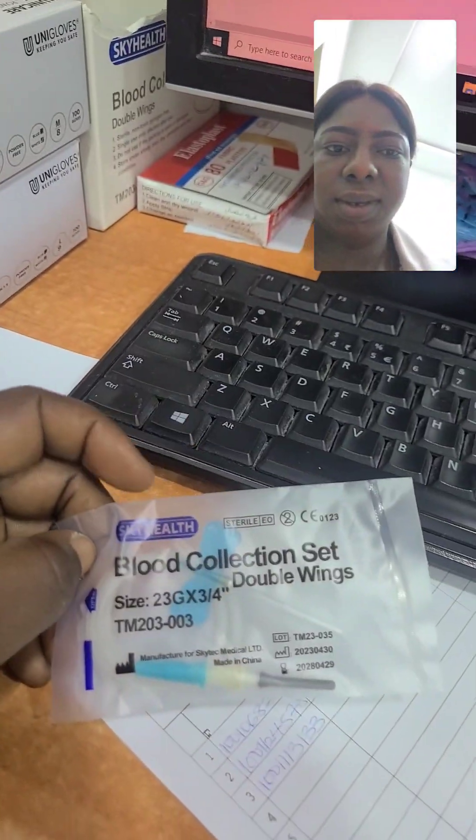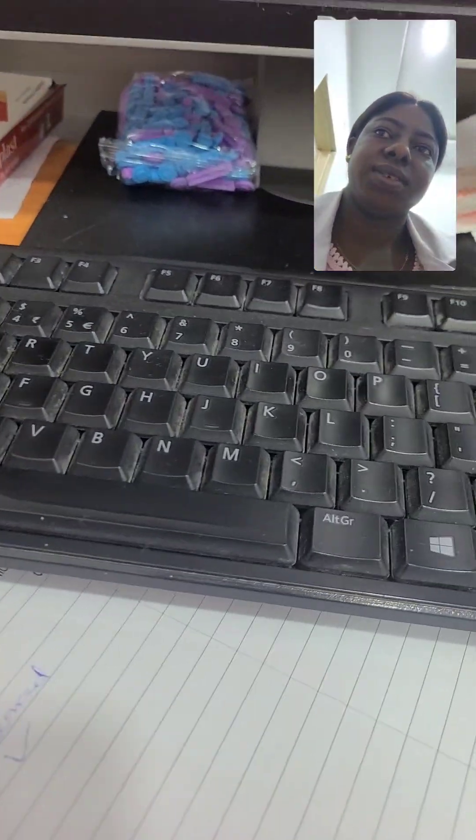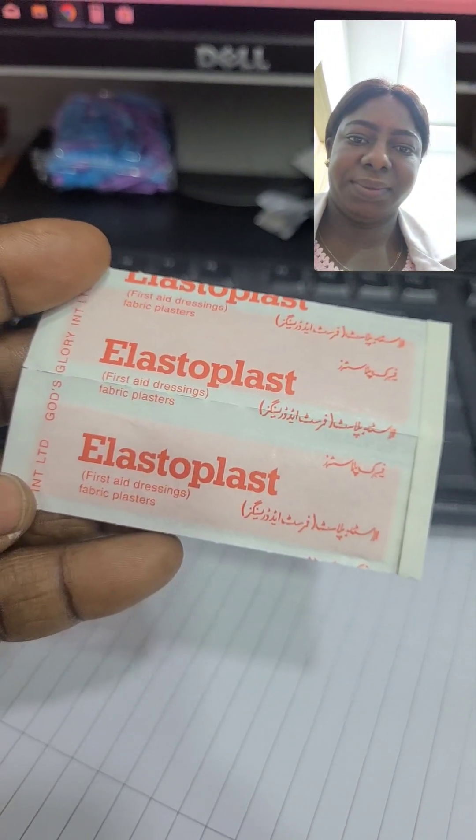Here is a blood collection set — we call it a butterfly needle — and we use it to collect blood samples. Here is a plaster; we use it to cover the site that we collected the sample from.